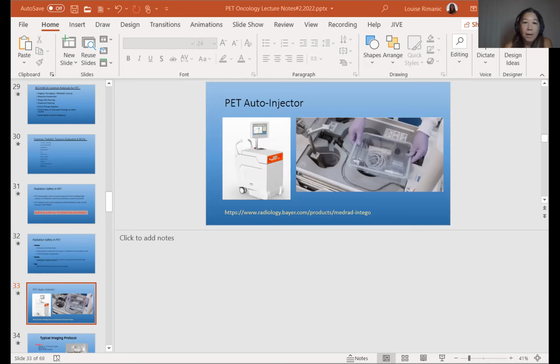But if they don't get the needle in the right place, the biopsy may come back negative, and yet the patient obviously has a high suspicion of prostate cancer. So imaging with gallium PSMA may help guide the biopsy needle to ensure that it's being inserted into an area that has active disease.